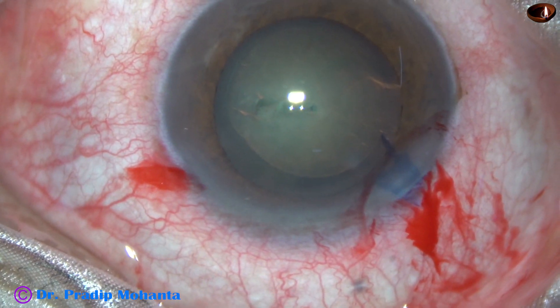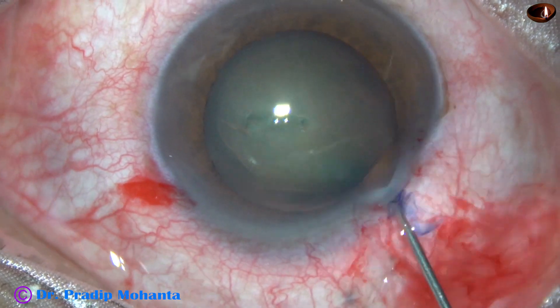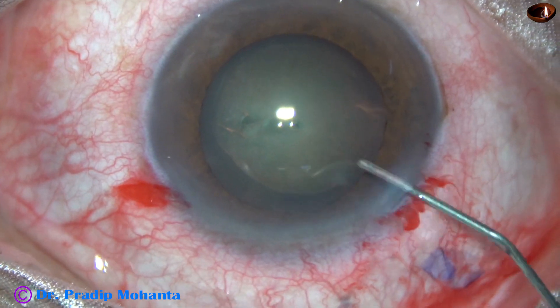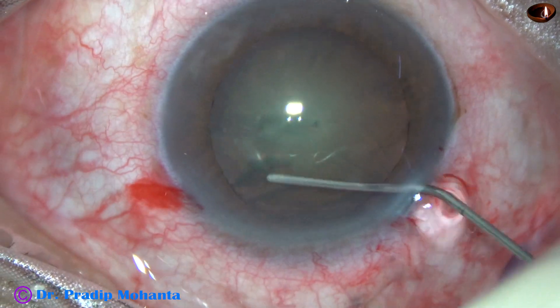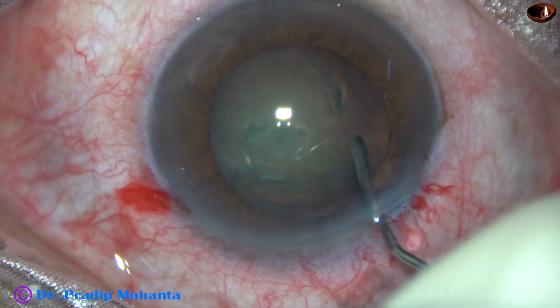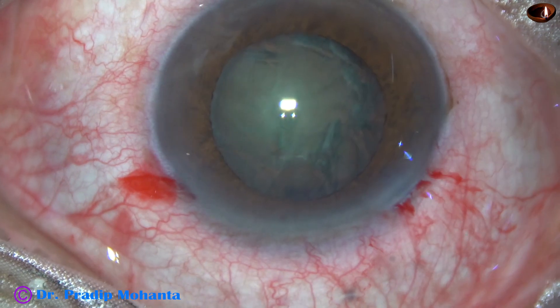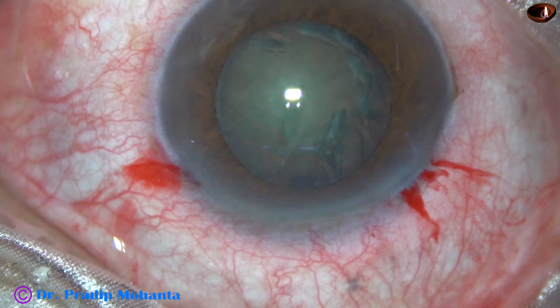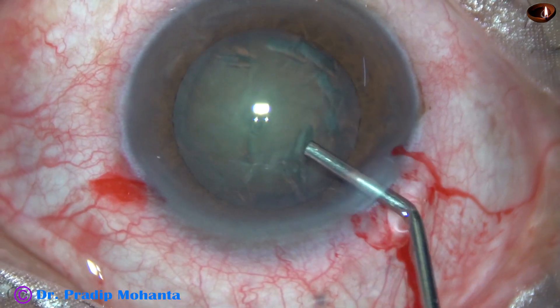Now hydrodissection is carried out with the help of a 27-gauge cannula and BSS. The fluid wave goes to the opposite equator. The nucleus is tapped and then rotated. Now notice the pupil has decreased in size.